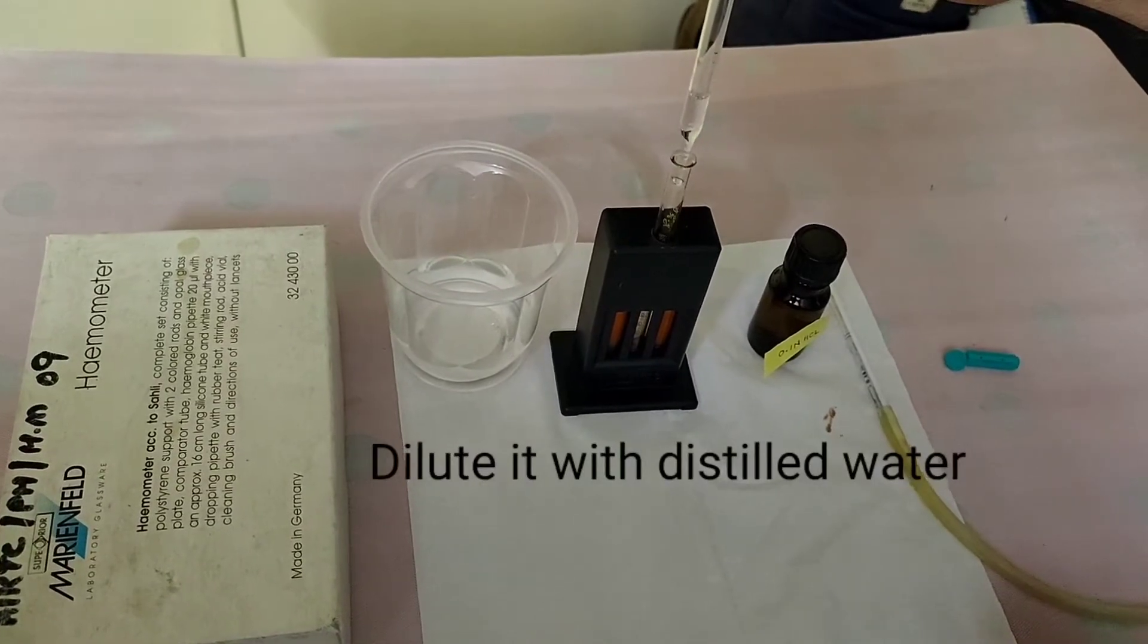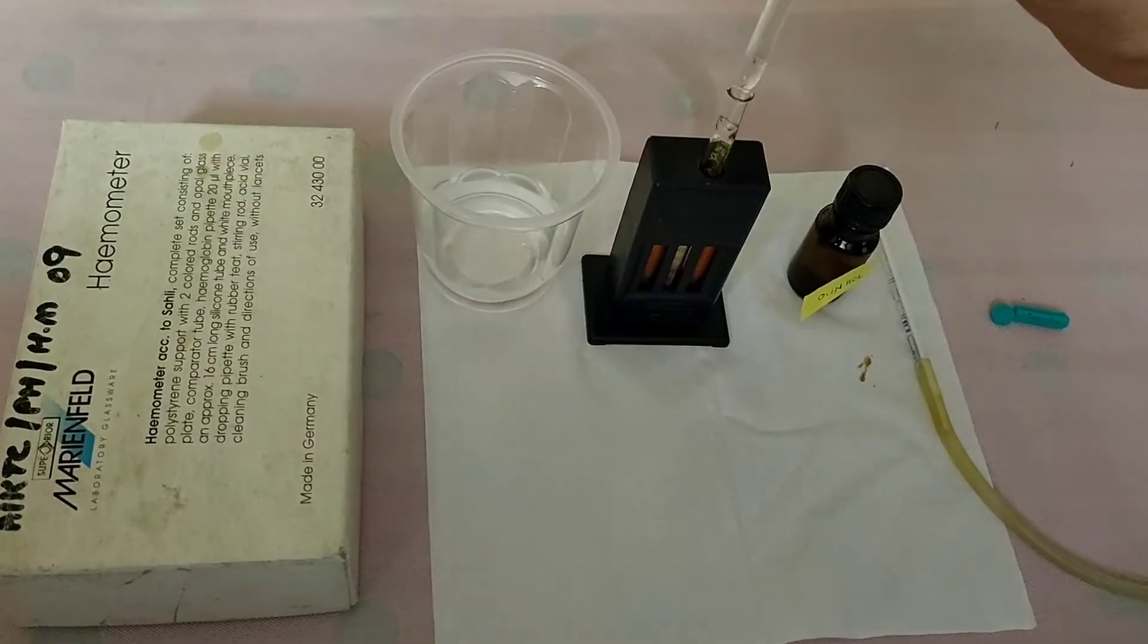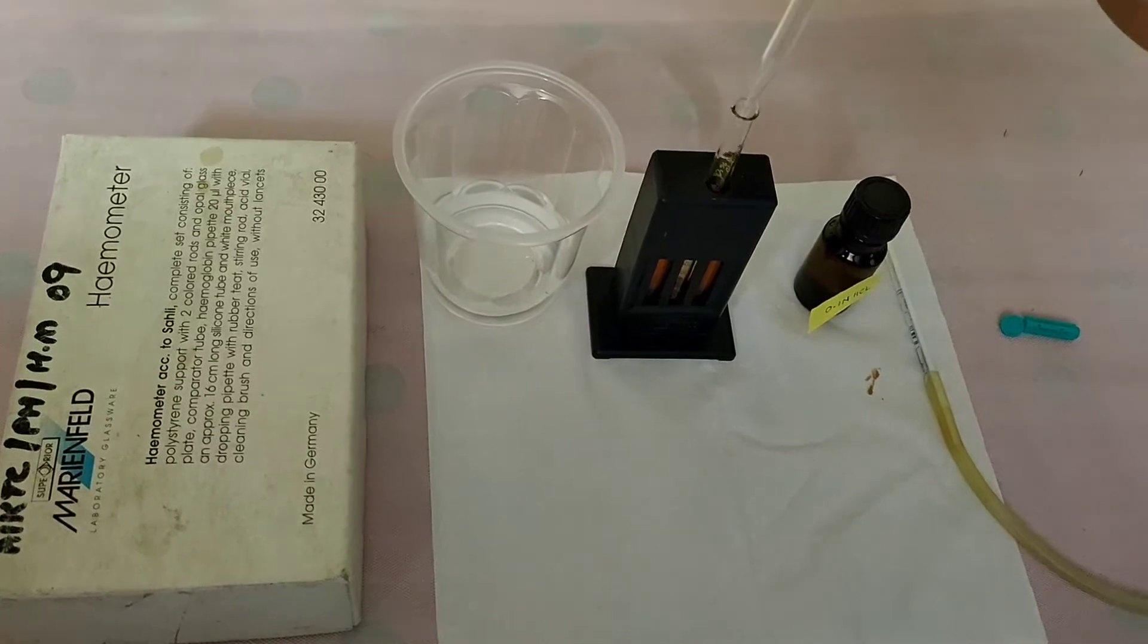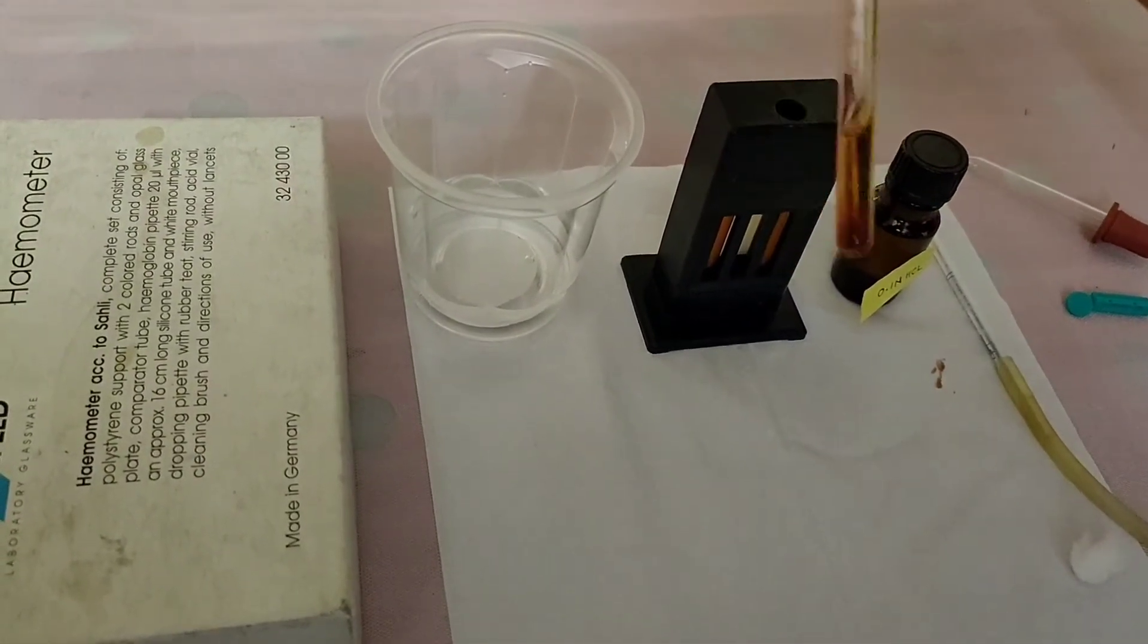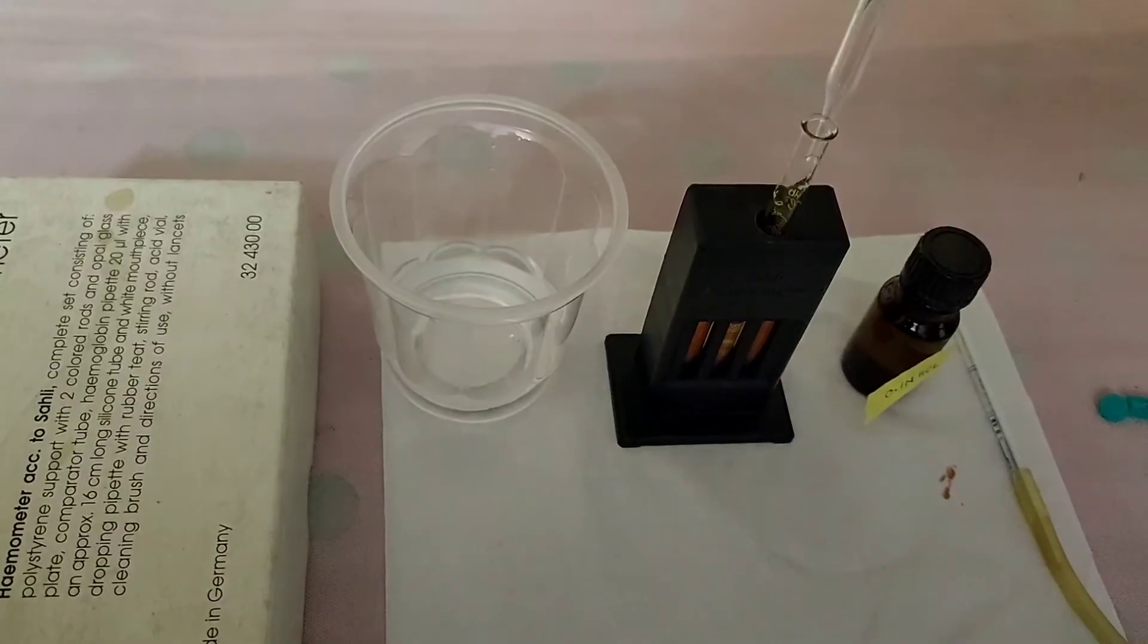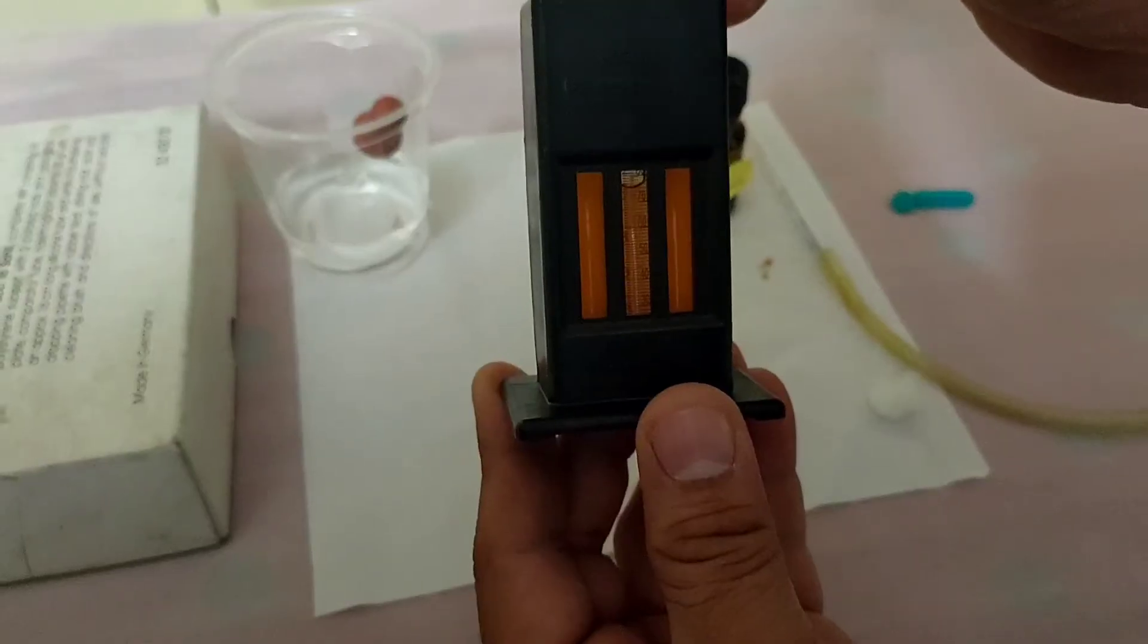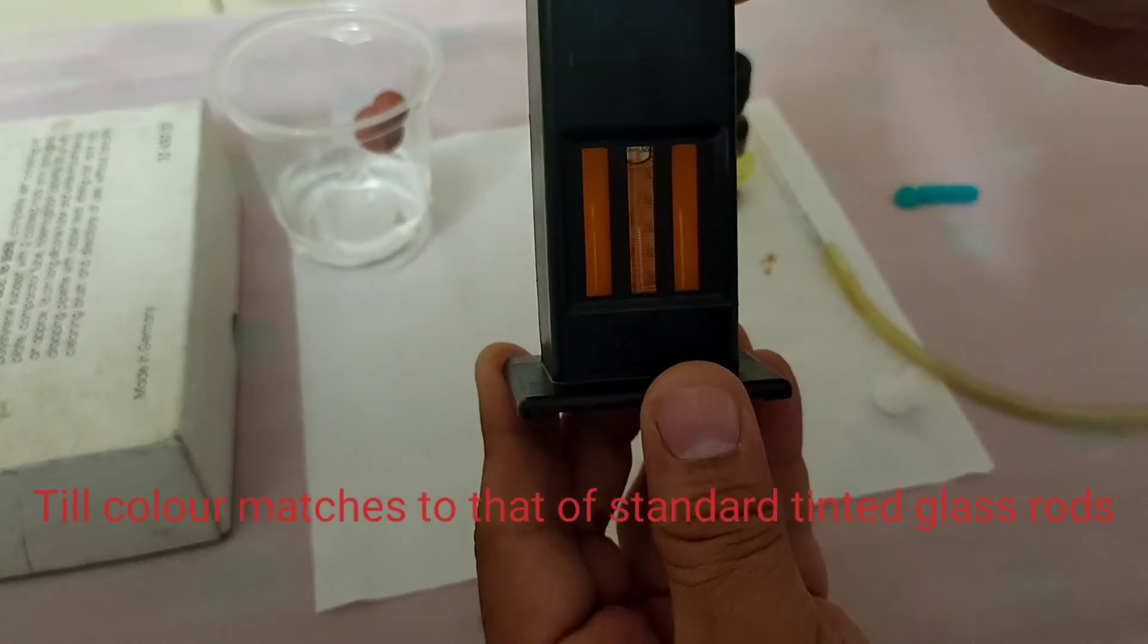Then, dilute it with distilled water. Dilute the solution with the distilled water till the color matches to the standard tint glass rod.